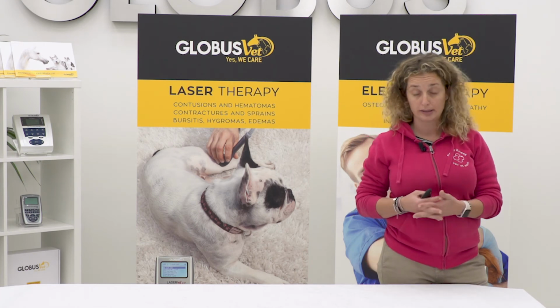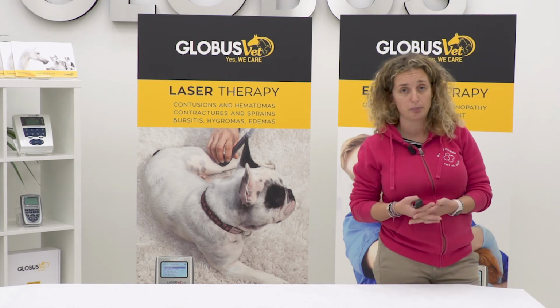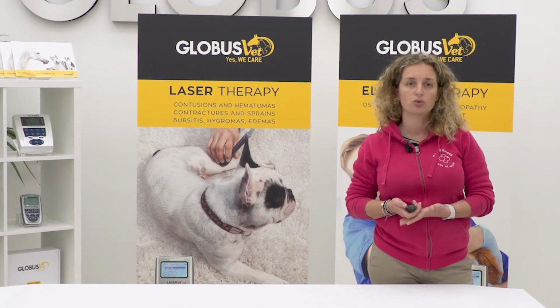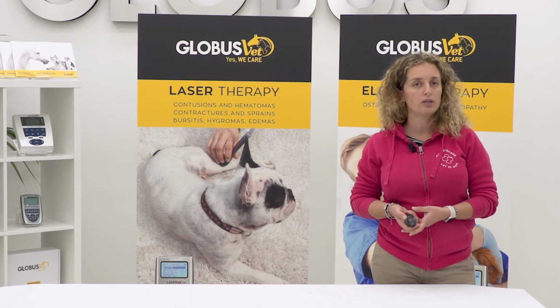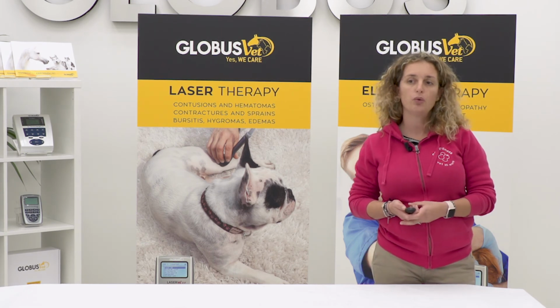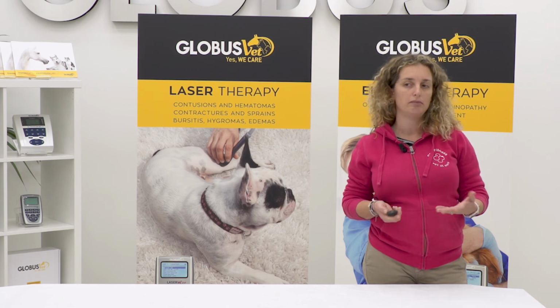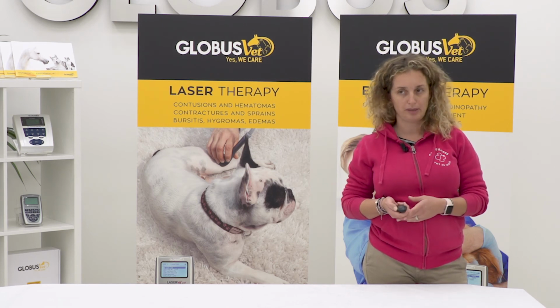But from that moment, we began to add the underwater treadmill, to improve posture and strengthen the muscles, which in an elderly patient is absolutely fundamental, all of this twice a week. Here we can see Lipo at recovery, with a minimal but nevertheless present lameness.